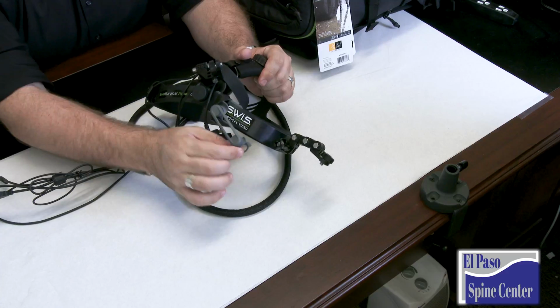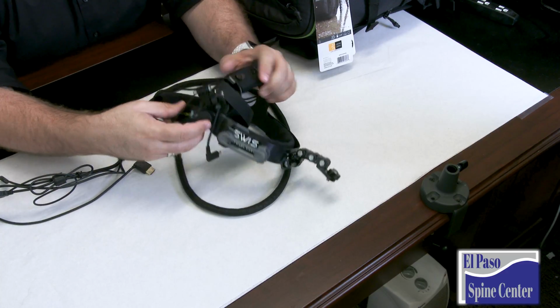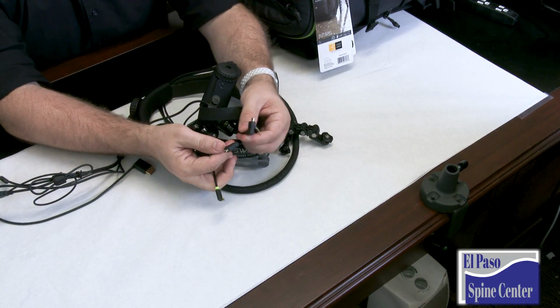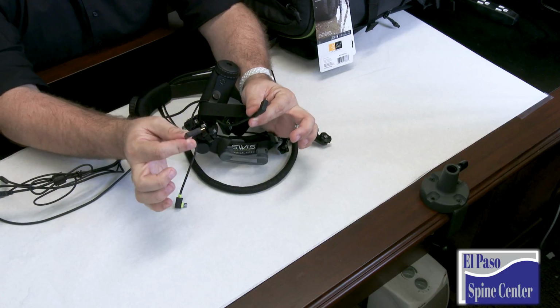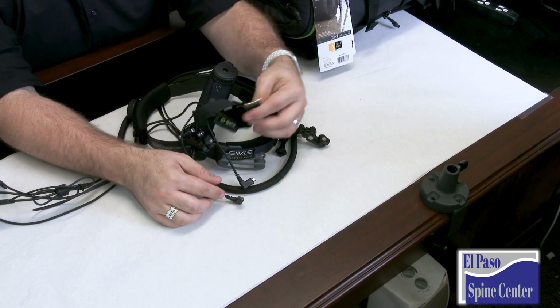This is where our viewfinder is going to go. We're going to come back to that in a few minutes. On the headgear itself, there are a number of cables. There are two micro HDMI cables. One is on a much shorter lead, one is on a little longer lead. One goes to the GoPro, one to the viewfinder. We're going to come back to that.